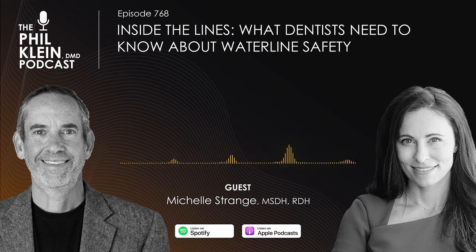And then from there, I think you need to start with your dental unit's instructions for use. Go see if your actual dental unit has any guidance. They might tell you. If they don't, then I would say, okay, what do we have capacity for? Is it tablets? Like, no. We have people like me who, while I'm filling up the water bottle, my brain has already gone, oh my gosh, I forgot to write up that last chart. Let me go do this. And I forget to put in the tablet, right?